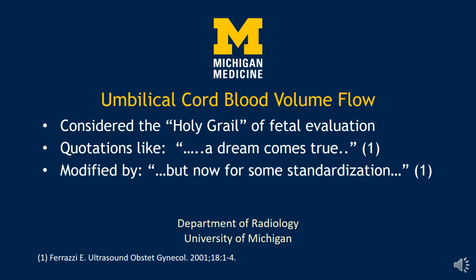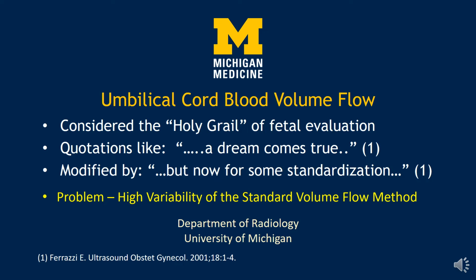Umbilical cord volume flow has been considered the holy grail of fetal evaluation. There are quotations in the literature like, "A dream comes true." However, they are often modified by statements such as, "but now for some standardization." The problem is the high variability of the standard volume flow method.